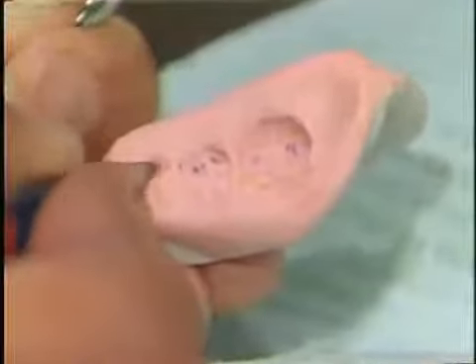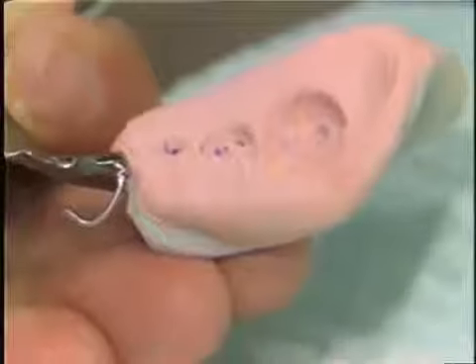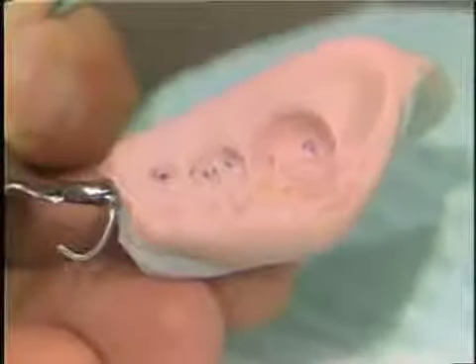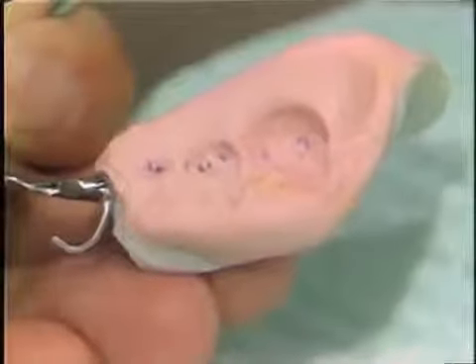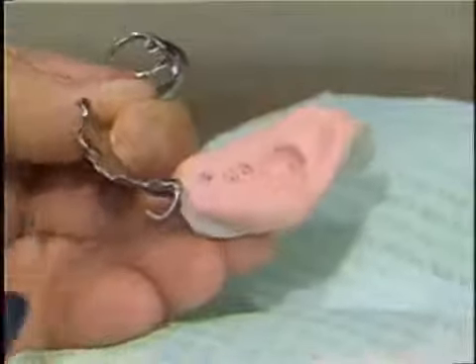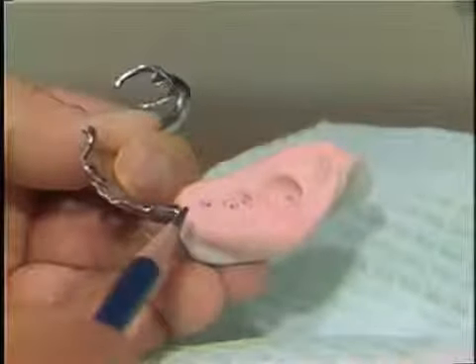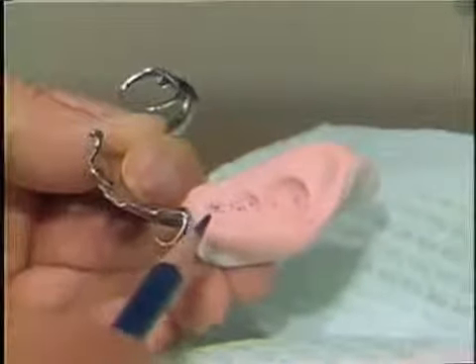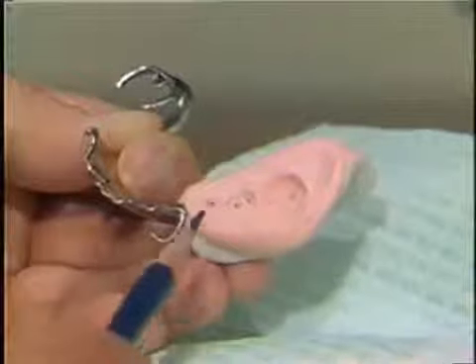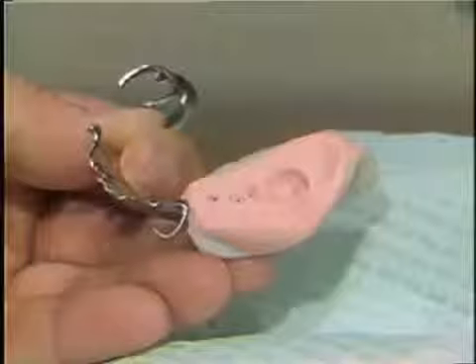And I mark those in the pencil so that when it is relieved, or when we take it to the arbor band or fast cut acrylic burr for the relief, we'll know the approximate level we're at. That would be probably the most inferior position of the opposing indentations.